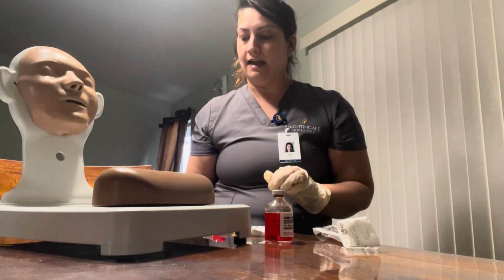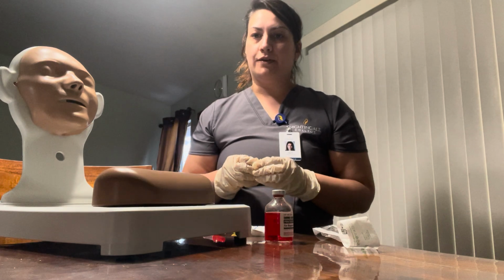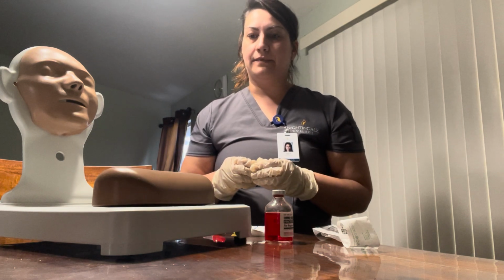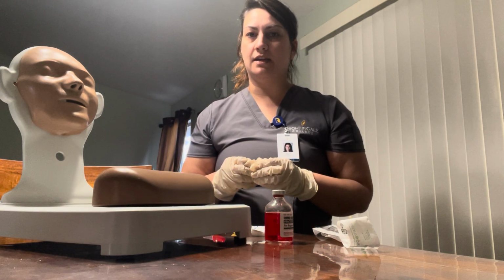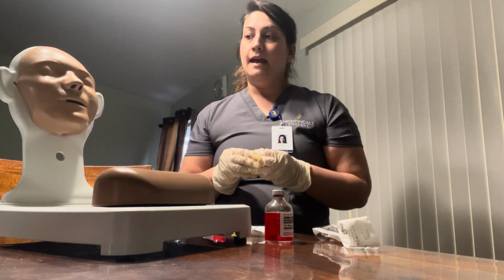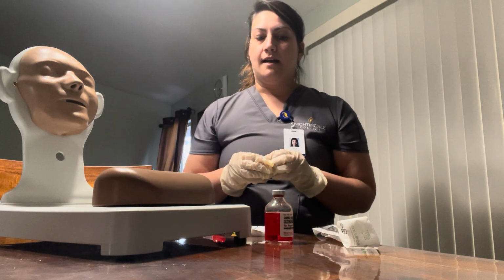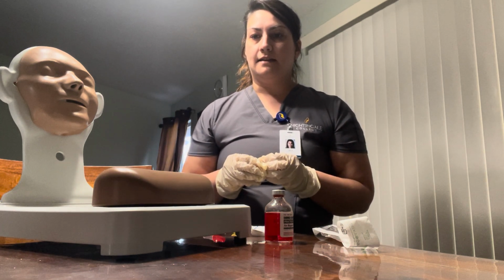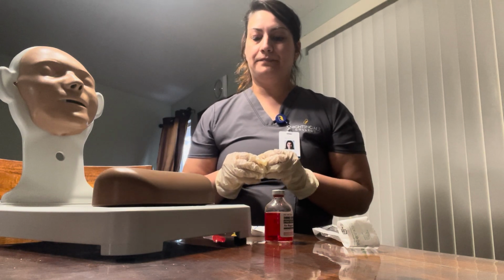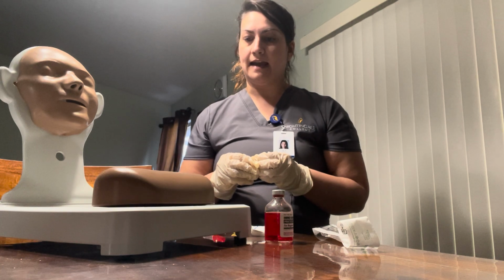Next, I am going to assess the site. Usually for subcutaneous injections, the patient gets it in her upper arm, abdomen, or the thigh. In this case, our patient, due to rotation methods, is going to get her injection in the abdomen. So I will assess the site.